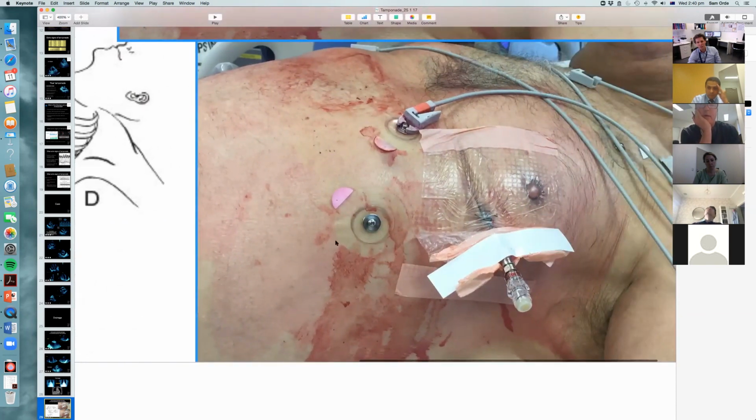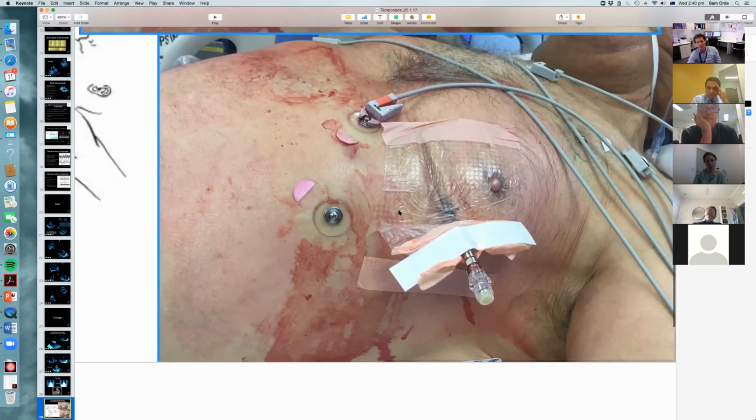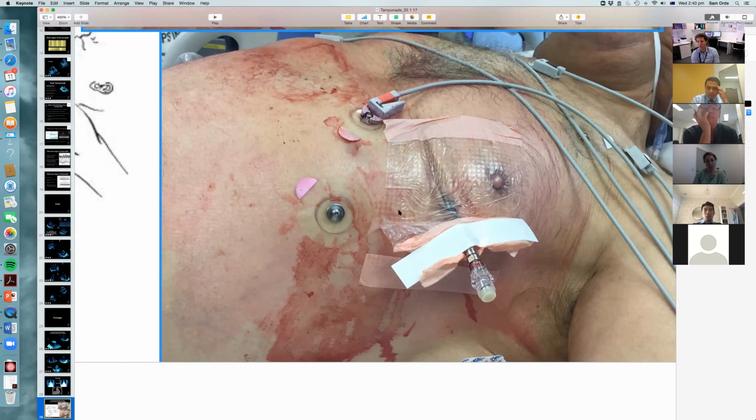And that's where you can see that I've drained in this guy, which I actually think I drained with David, didn't I? Dave, I think this was the guy that you and I did a few years ago. But you can see the direction of that needle. That is not the direction that you'd be getting an apical four-chamber view from. I've swung it round and aimed up so that you've got the biggest landing zone and you're going away from the right ventricle.